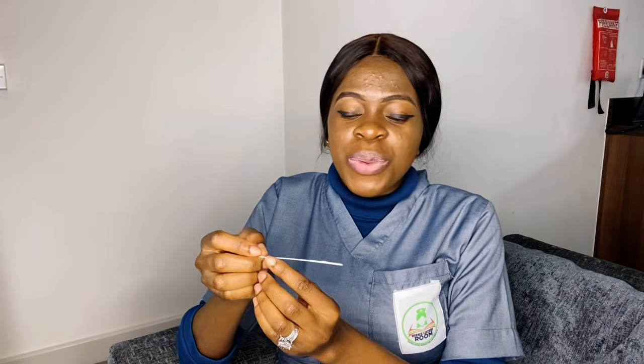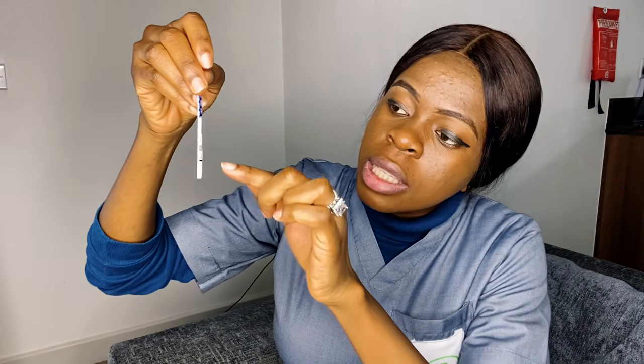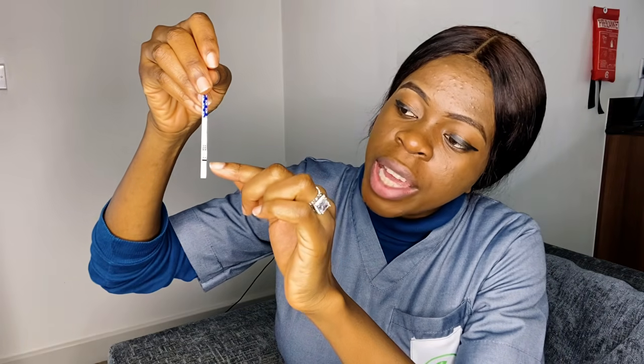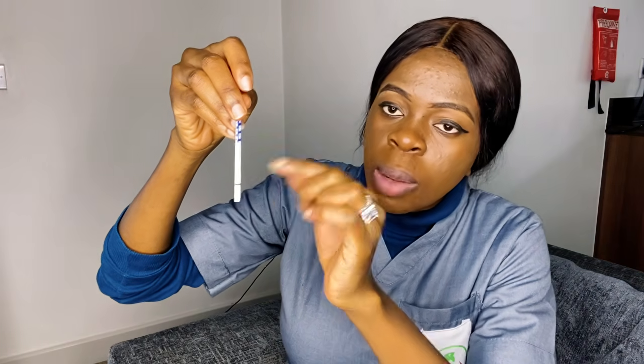So when the urine is ready, you can see this is the strip. I just hope you can see it properly on the screen. This is showing marks. That means this is where the fluid should get to. This black line is the mark it should get to. So I'm going to be taking the two samples and dipping two different strips into them. Then we'll observe and see which one has two lines.